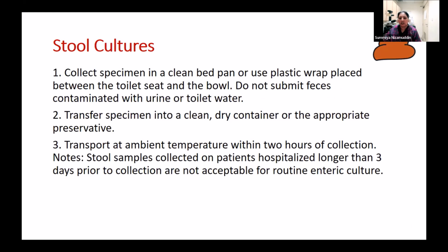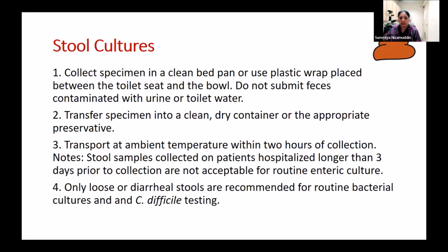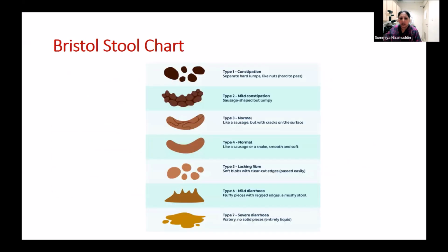Okay, and if your patient, for example, is admitted in the hospital for longer than 3 days and has developed diarrhea, chances are कि यहाँ पे C. diff होगा. फिर यहाँ पे आप रूटीन बैक्टीरियल कल्चर के लिए सैंपल्स ना भेजें. Only loose and diarrheal stools are recommended for routine bacterial cultures and C. diff testing. So पूछ लीजिए पेशेंट से कि स्टूल की कंसिस्टेंसी क्या है, और उसमें जो है ये वाला चार्ट हैंडी आता है.